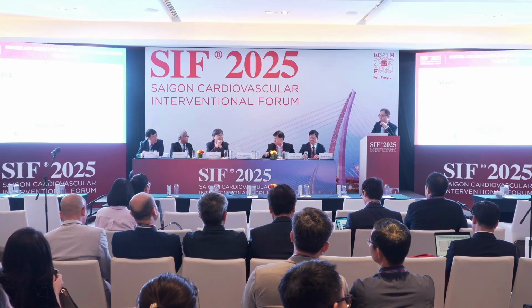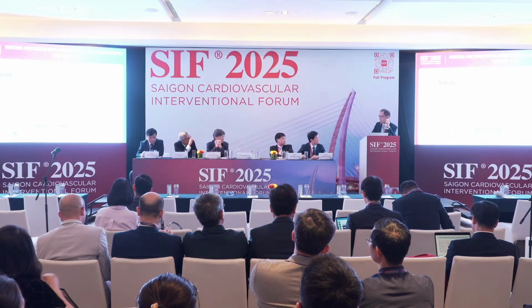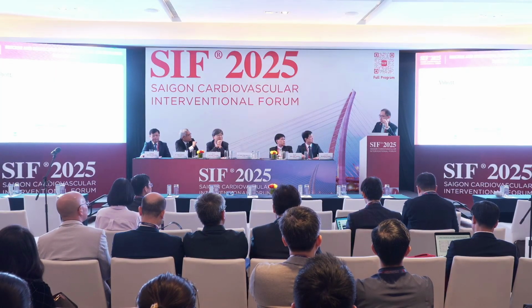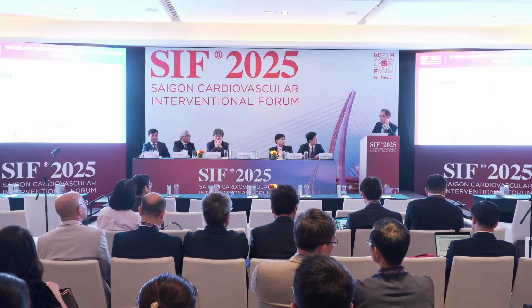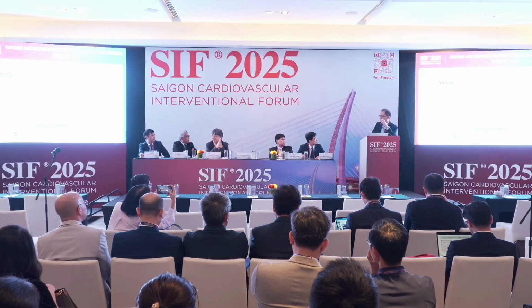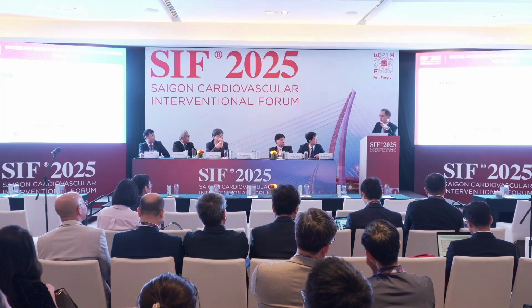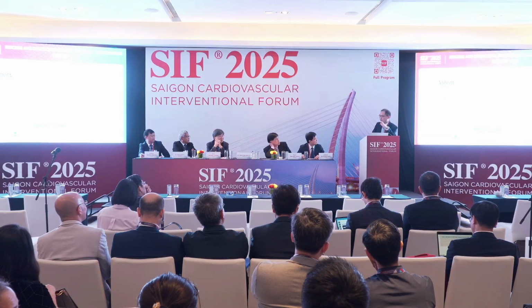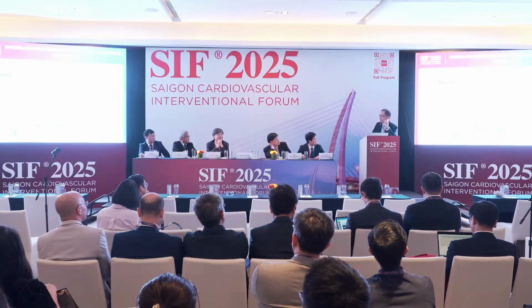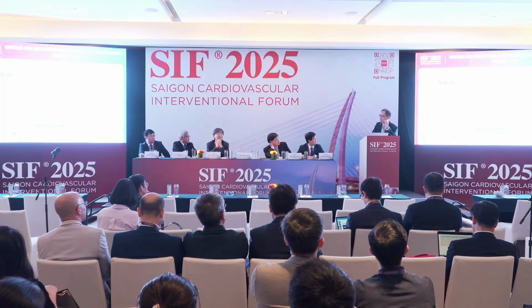Yeah. So in that case, I think a trough caused by the wire bias, and this case was unstable. And this was a culotte stent, and I was actually quite fearful of disrupting it with further instrumentation. The plan was to bring her back in a few months' time to do a relook and hope that that trough, and I suspect extension of blood into the adventitia, we would have to relook on imaging. But I didn't want to do too much, frankly, at that time because it was an unstable patient.